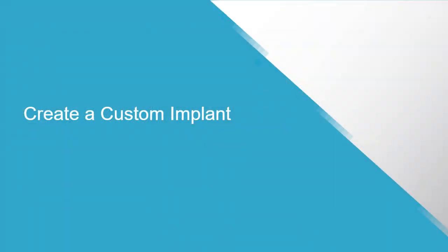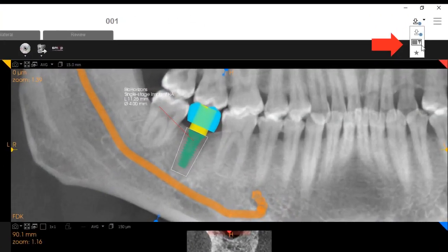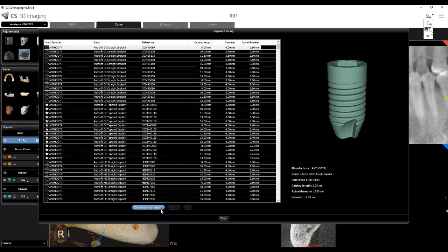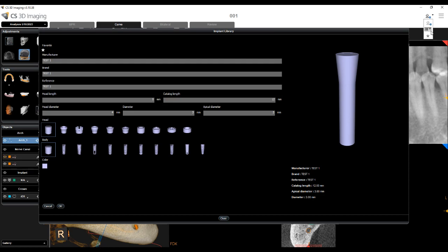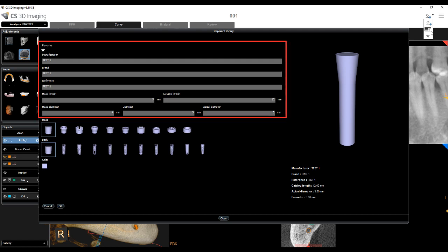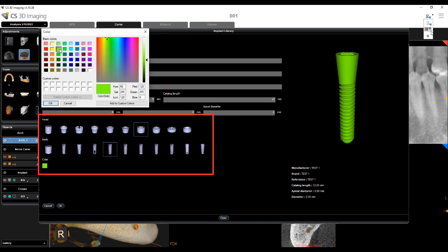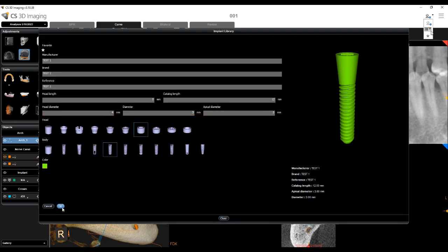Create a Custom Implant: To create an implant, select the implant library icon to display the implant library. The implant library window appears, showing the list of available implants and their details. Click Create your own implant. The window displays fields for configuring an implant — specify the manufacturer, brand, reference, length, apical diameter, and diameter. Then use the head, body, and color picker to configure the shape and color of the new implant. Click OK. The new implant is added to the implant library.